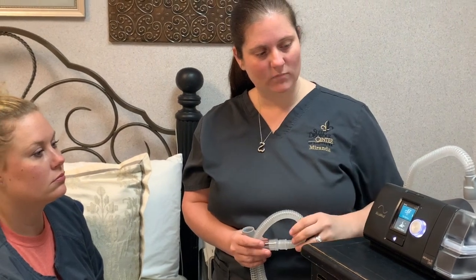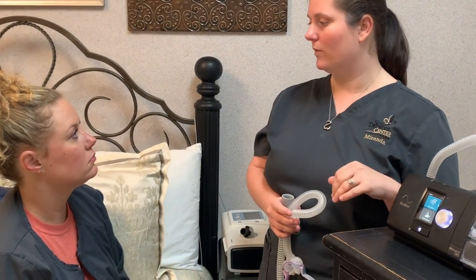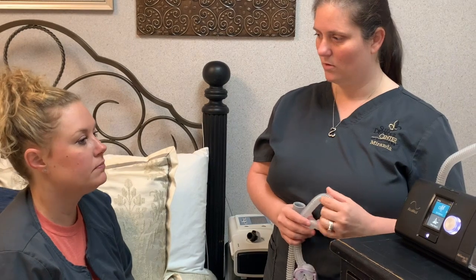There is a cellular wireless modem in the machine — it's how we track your usage and compliance. It's also how we make any changes to your machine remotely. So if you have any problems or issues, just call us and we'll go over that report with you and make those changes and send them straight to your machine.